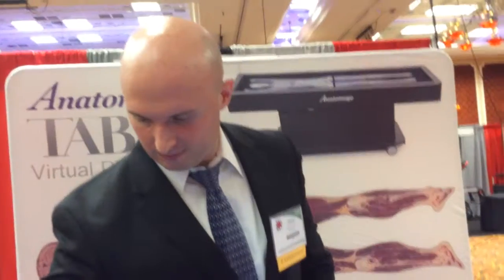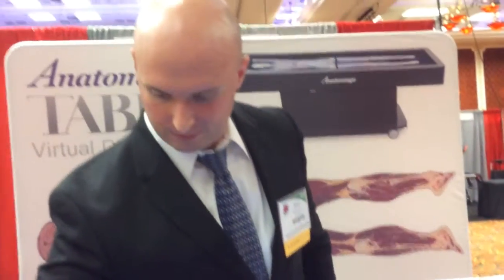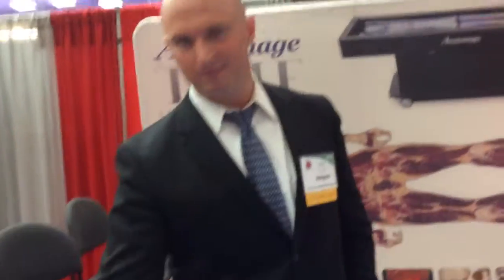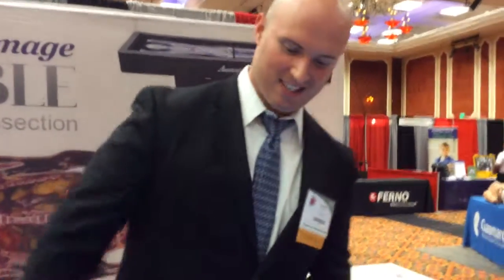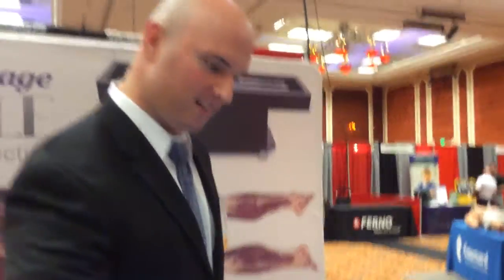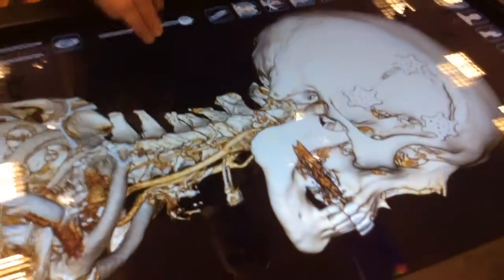Cool. So physicians can look at their patient in 3D and plan out their surgery on this table. This table could be sitting in a room just off the OR, like a conference room or something, and they can plan it out. That's incredible. What they'd use now would just be an X-ray box, or a laptop or desktop computer, alternatively. I'm not sure. I'm guessing an X-ray box or a computer with X-ray images. So this is really images on steroids.